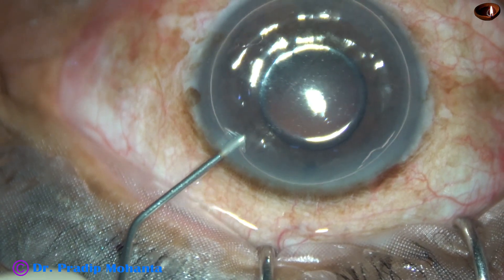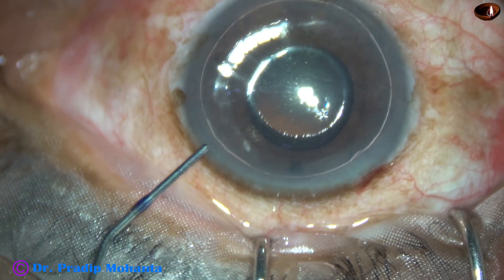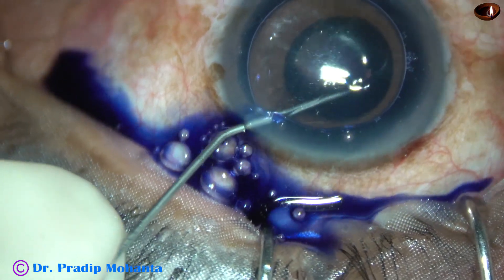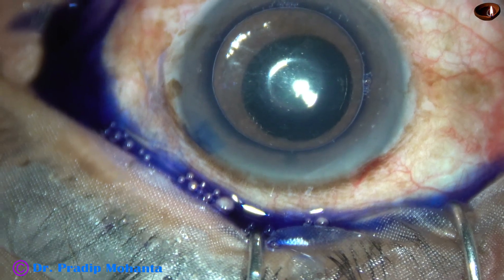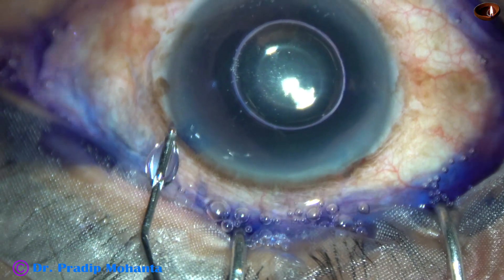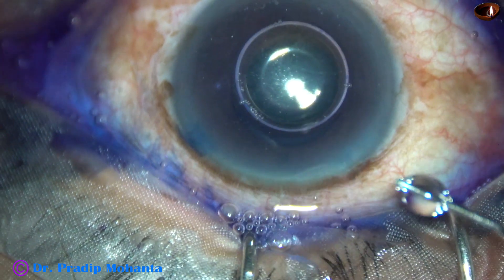My plan is to stain the anterior capsule underneath this air bubble, and here goes the trypan blue dye. The size of the pupil in this case is about 4 mm, and this is a bit of adrenaline.